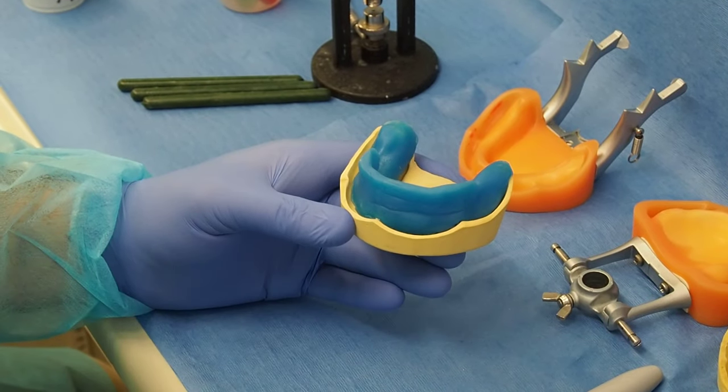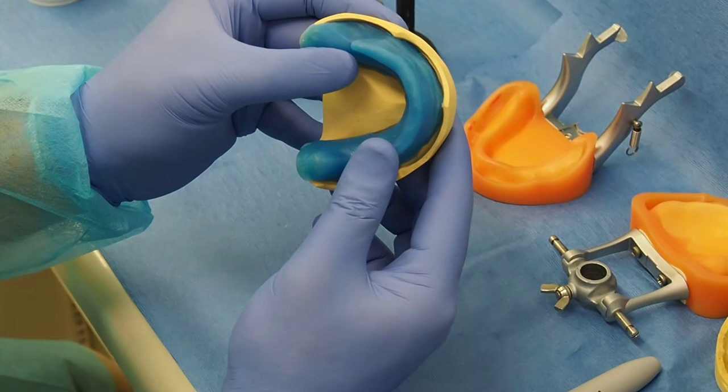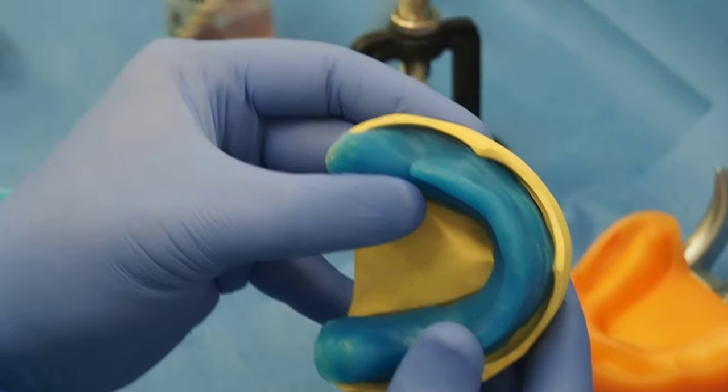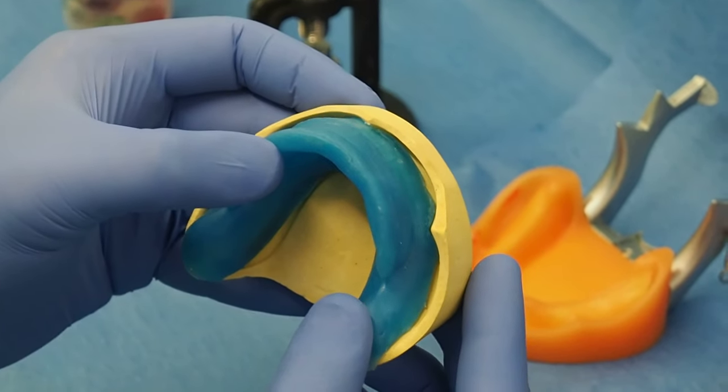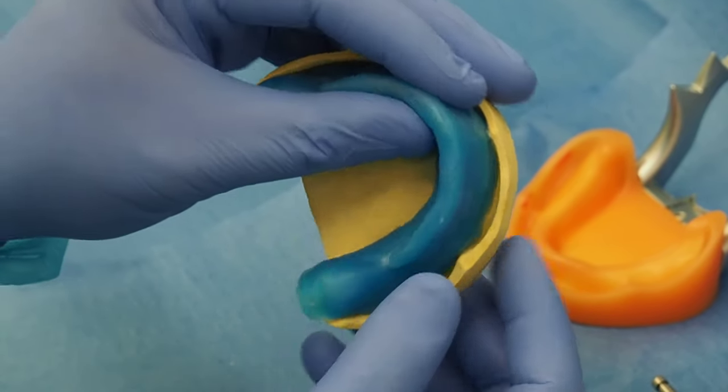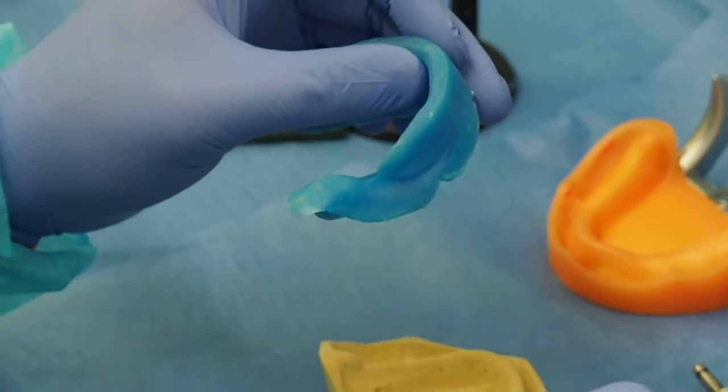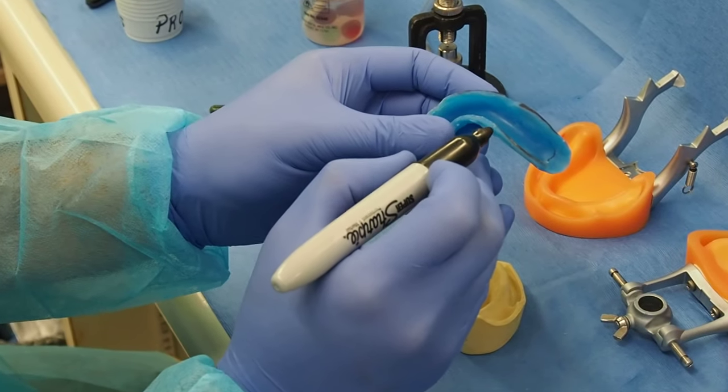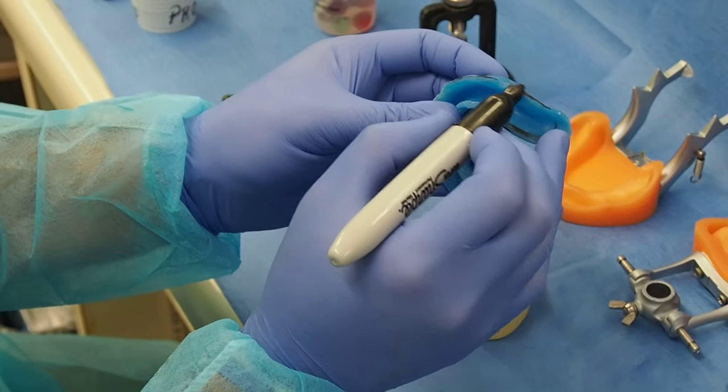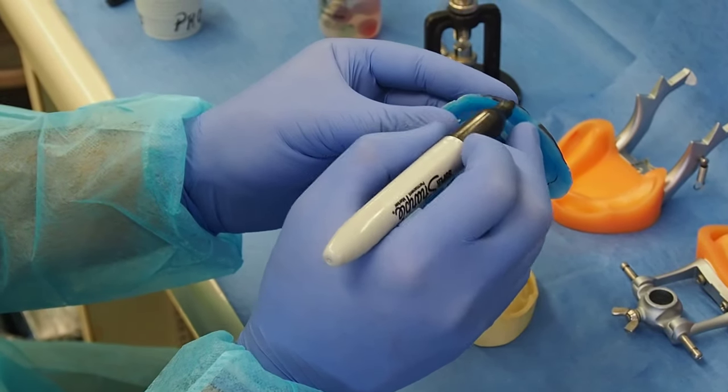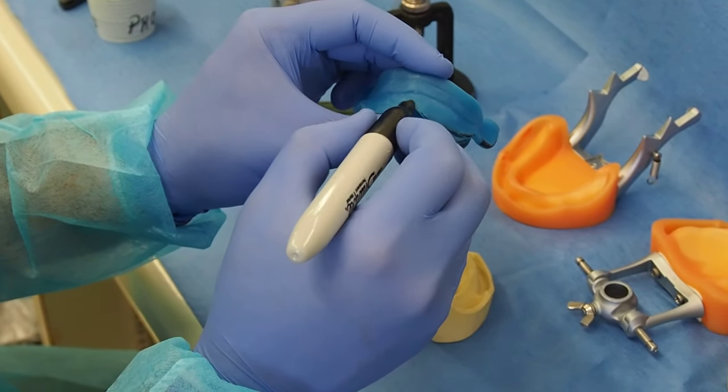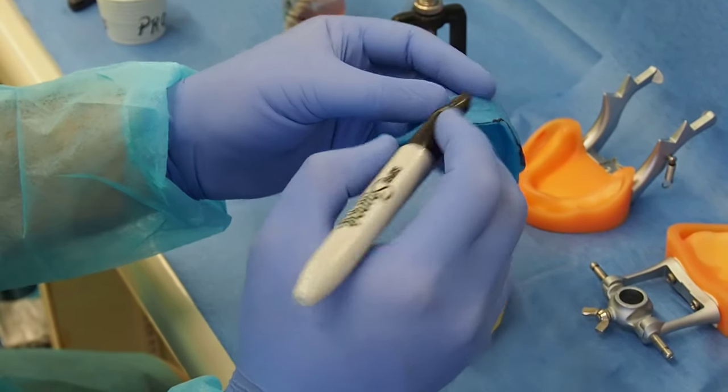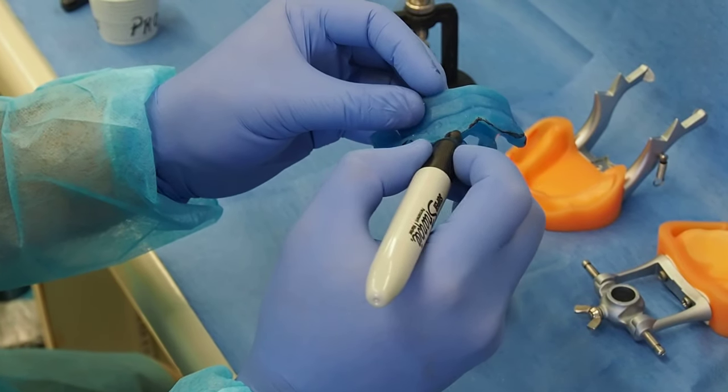Now in this case, if you see it here, can you make a close-up right there? It's completely overextended. It's reaching the deepest part of it. It's pretty thick also on this side here, you see. So I always like to point it out with maybe a sharpie or something so I don't get lost looking at all this blue stuff.